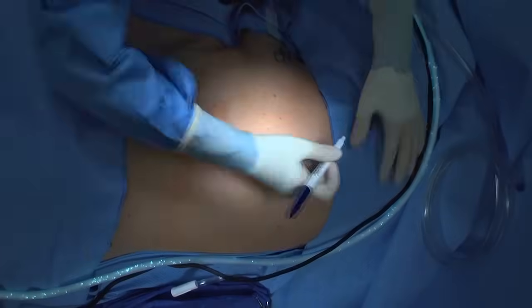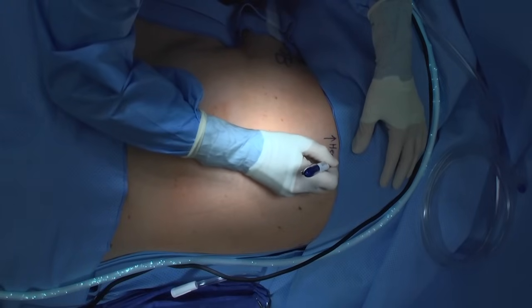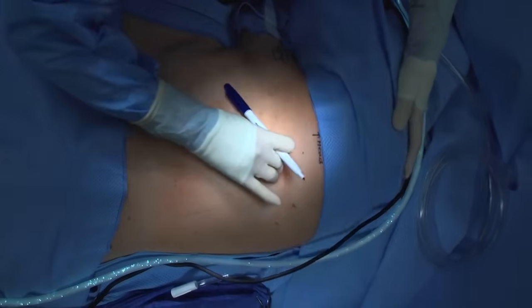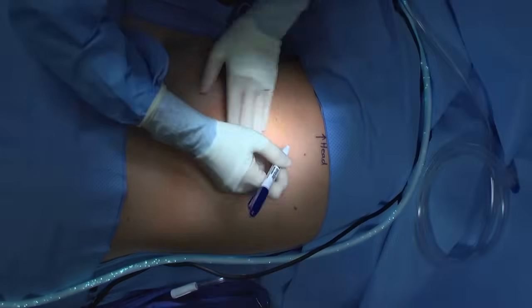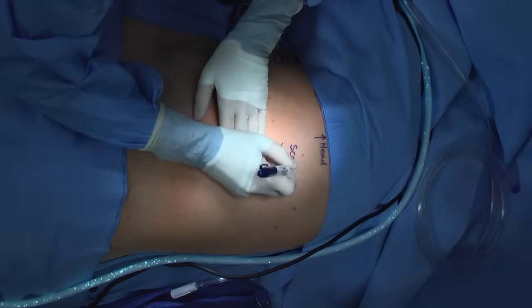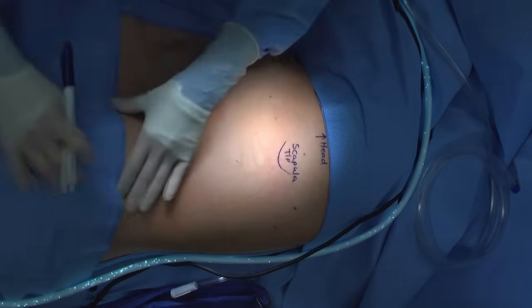Here is our patient. We always begin by taking time to identify our landmarks. To help orient, the patient's head is to the right of the screen and her feet are to the left. It is always important to identify your landmarks, even in an emergency situation, because you want the tube to go in quickly and into the right place. This time up front is well spent and saves the time and effort of a poorly placed tube.